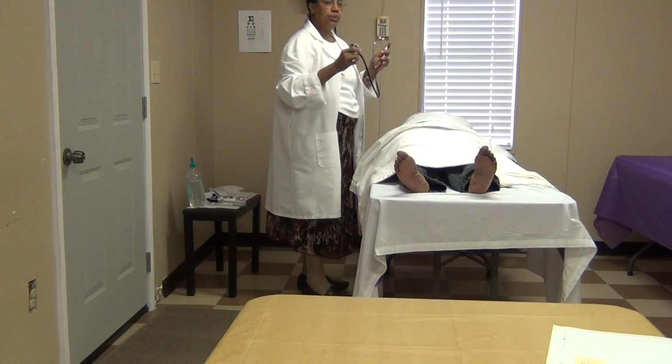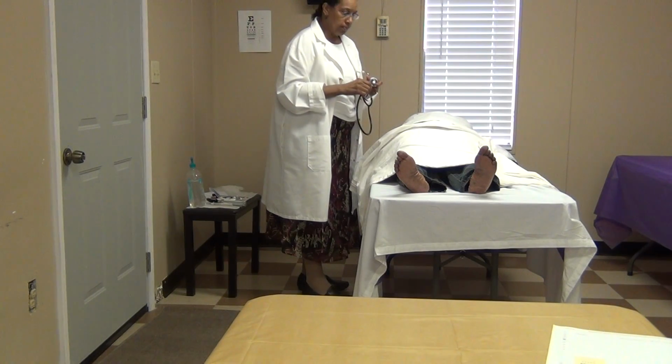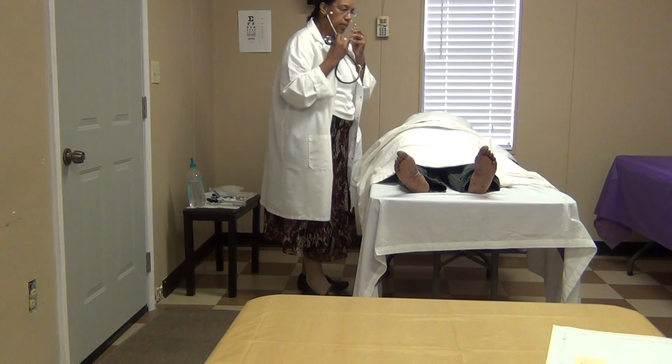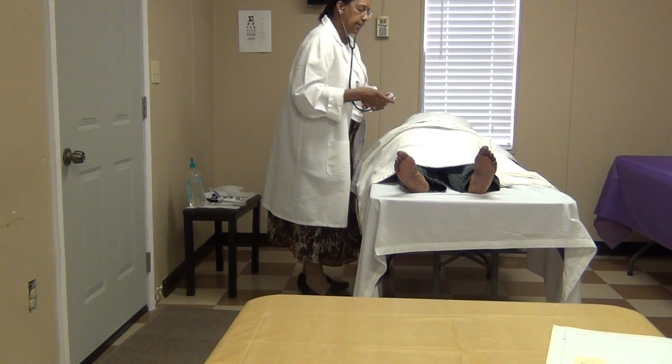I'm also going to auscultate for aorta bruit, and I'm using the bell of my stethoscope.